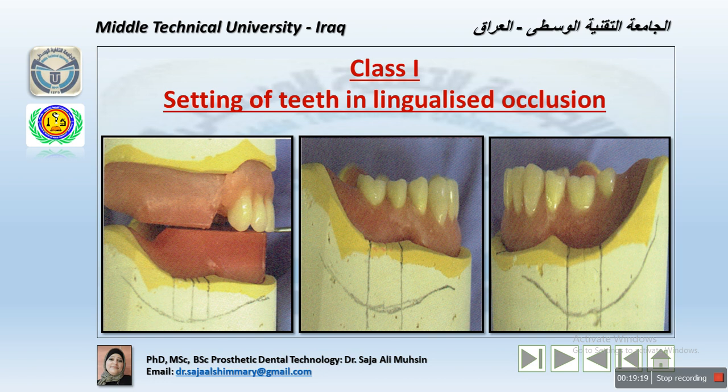Now, this can sometimes lead to a shortened occlusal table, as in the image on the right side. As you can notice, we use the canine, one premolar and one molar, and this is the shortest, because otherwise we cannot occlude the teeth in a position with the upper in terms of lingualized occlusion.